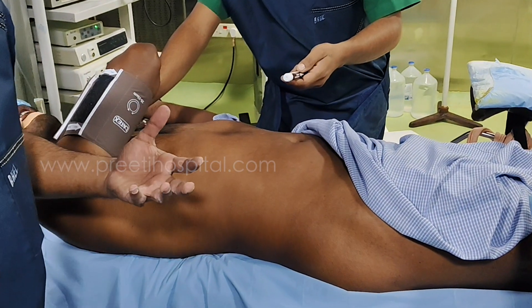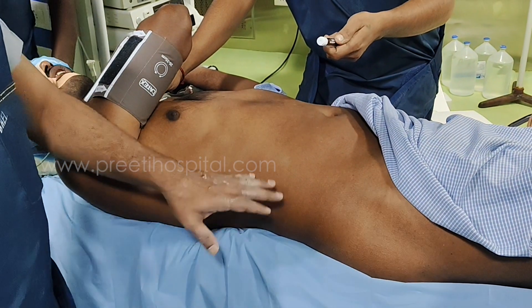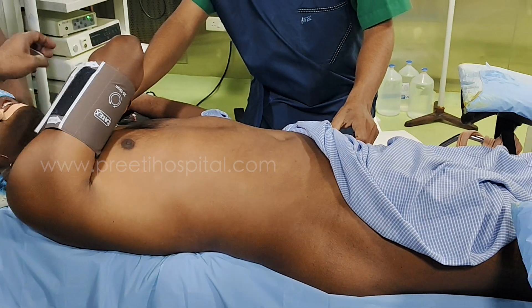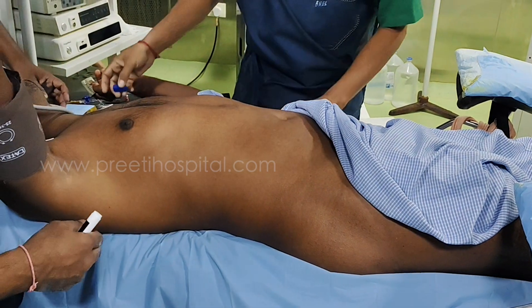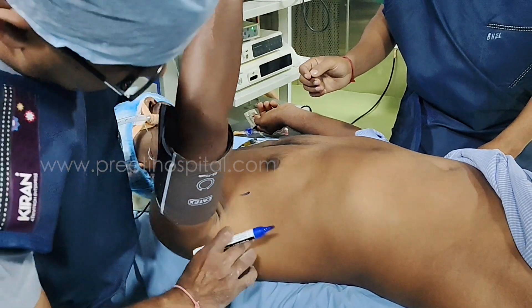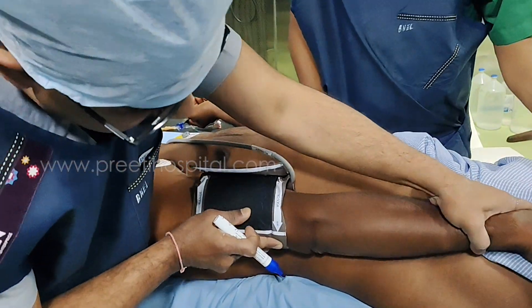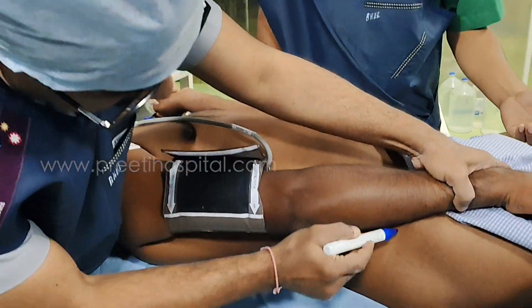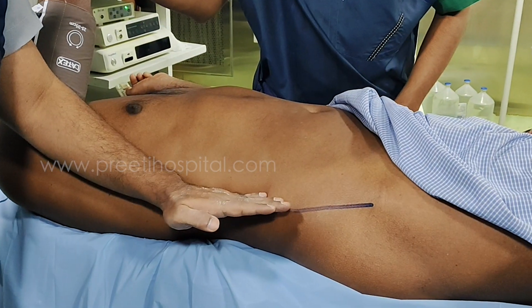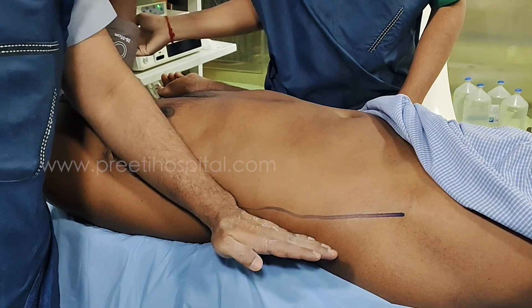So we should use landmarks. Landmarks are better in prone PCNL because the back is all kidney. In supine you are away from the kidney. The most important landmark is the posterior axillary line. In neutral position: this is the anterior axillary line, this is the posterior axillary line, this is the mid-axillary line. Keep the hand by the side parallel. Lie on the right. The puncture site should be posterior to the posterior axillary line.